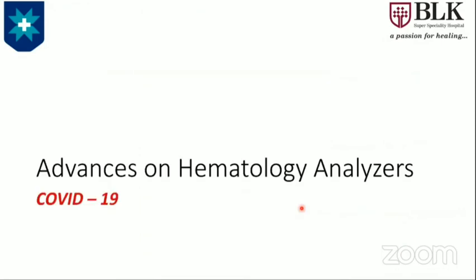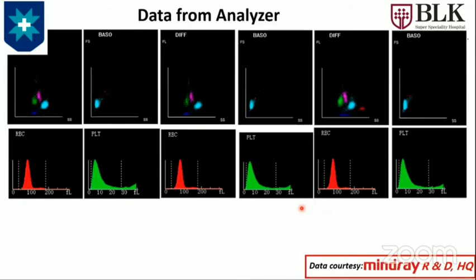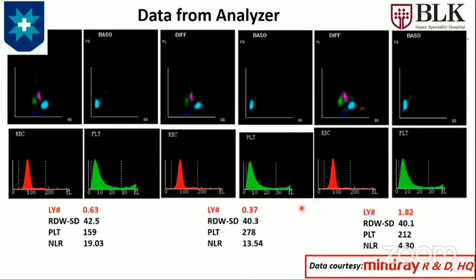Now, my talk would not be complete when I'm talking about parasites, especially in the era of COVID, because COVID happens to be an important aspect where hematology analyzers certainly seem to be playing a very interesting role. If you look at the plots up here and down here, they might not make a huge difference to your understanding of the whole aspect.